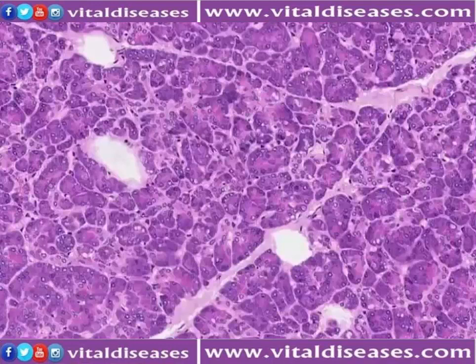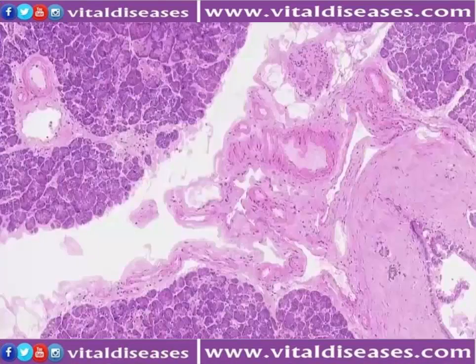The pancreas contains a large amount of connective tissue. The septi divide lobes of the pancreas. We see arteries, veins, and capillaries throughout the connective tissue. Here is an artery and vein, and more connective tissue in the center of the image. In the lower right of the frame, we see our first large pancreatic duct.